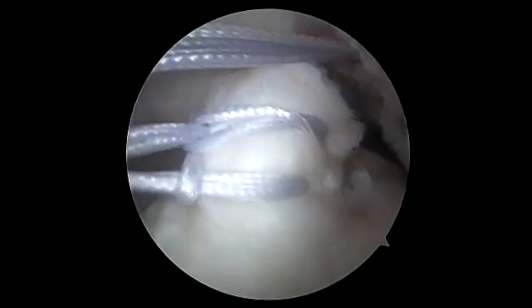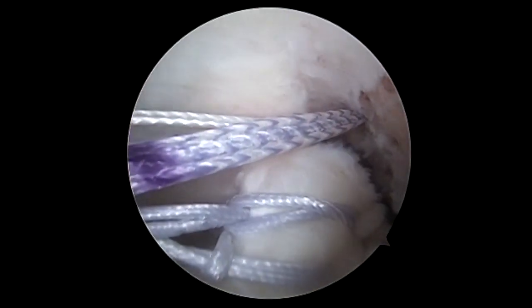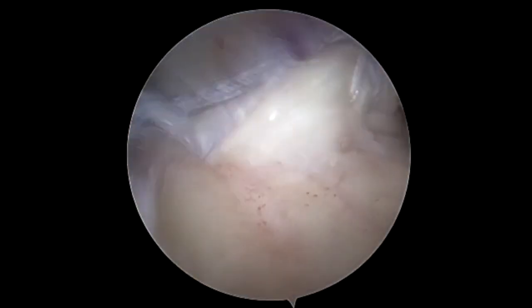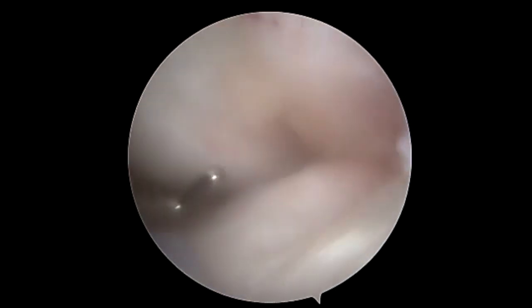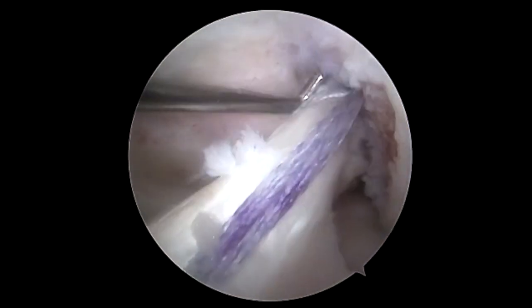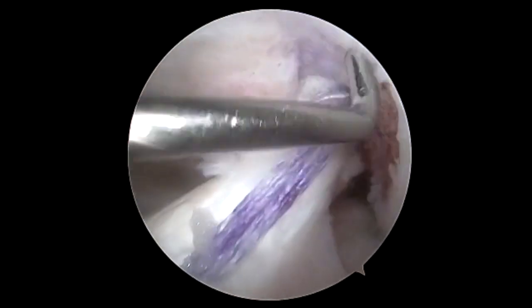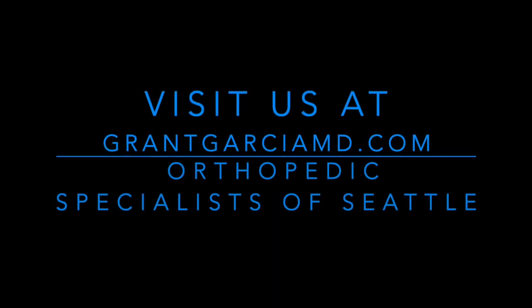We're passing it up into the tunnel. You can see the fiber tape — we're holding on to the fiber tape as we're doing this. You can see we flip the button, check it on x-ray, and then we dunk the internal brace. We fixate the internal brace and you can see here we've retensioned the ACL. We have excellent tension of the ACL back up to the footprint, and this completes the ACL repair. The Lachman has completely returned.